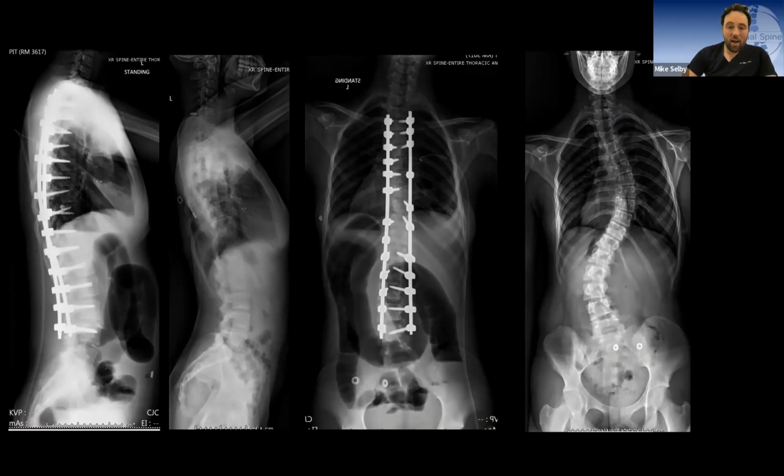What do you think? Well, look, I think here you've restored some lumbar lordosis above that, which is very good. And look, I think a lot of the judgments that we make on stopping at L4 may be related to older implants, although I have seen it happen with modern pedicle screw constructs. But I think attempting to get that balance a little better may well be protective on those discs. And sometimes you have no choice. If she's still super rotated on the table, it's really hard to say, I'm going to stop at L3.